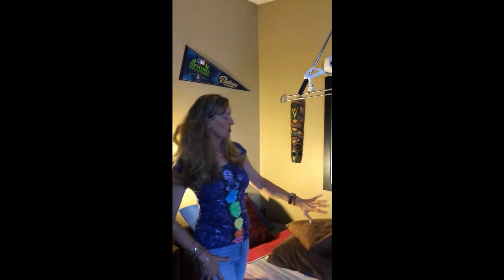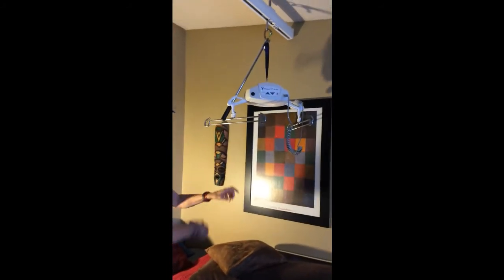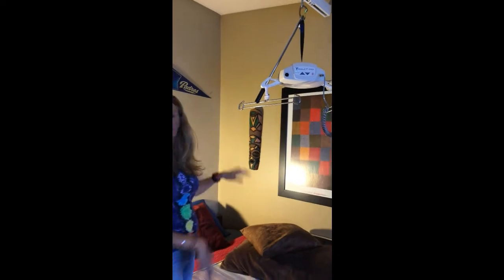So once it charges for a couple of hours, we can take it apart and put it away so it won't be in anybody's way.